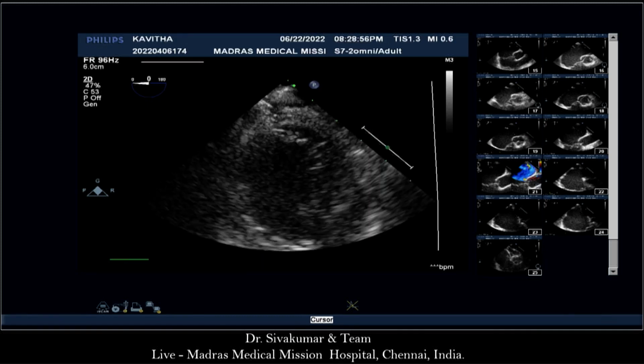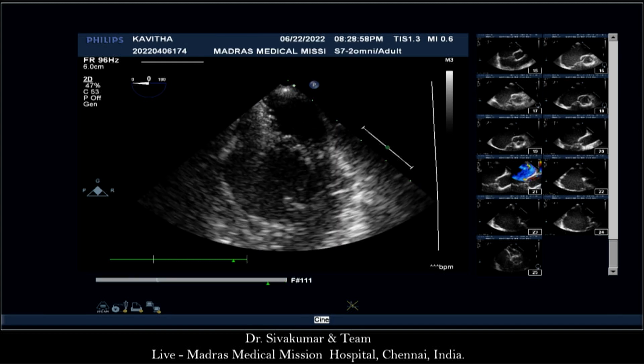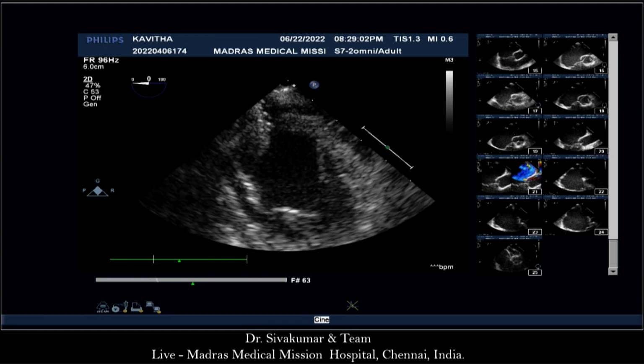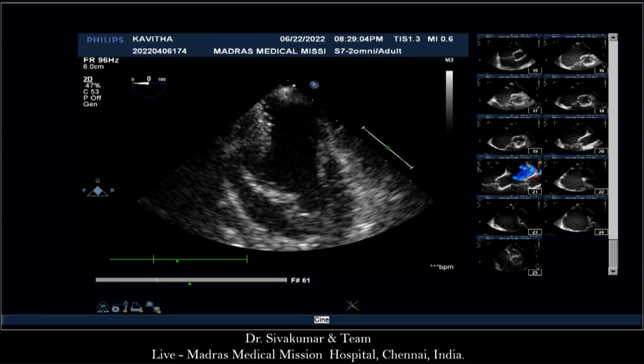We got to look at this mitral valve very carefully. I'm not happy about it. I'll be honest with you. You can prove it, but I'm not. I think it's a very big device. It works. Hey, Peter, do you have a comment?